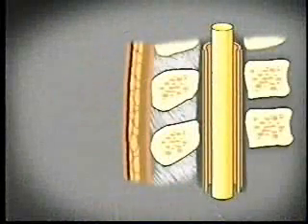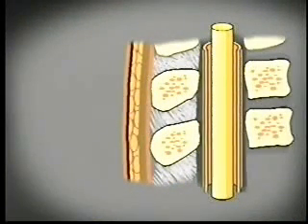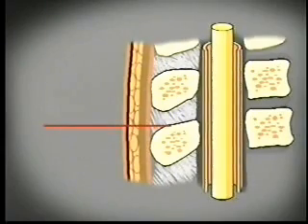Here at the tip of the spinous process, you will need only a small entry angle, 10 to 30 degrees, depending on how flexed your patient is. The most common error is failure to enter just below the spinous process. If you are too far below the process, you will hit bone regardless of the angle.